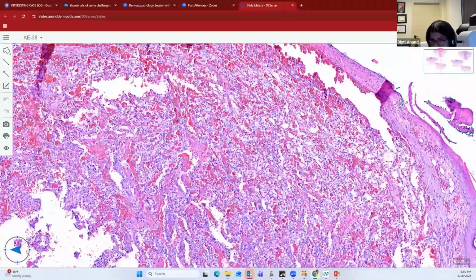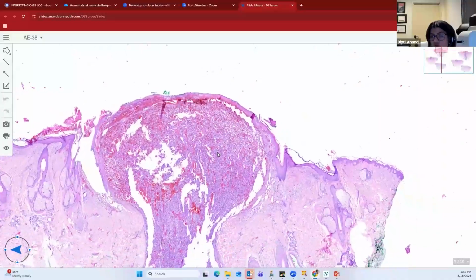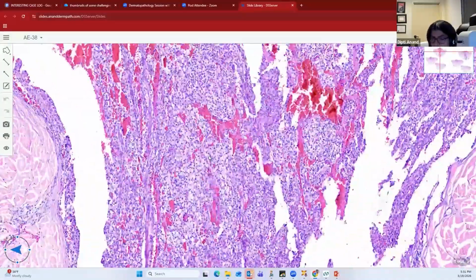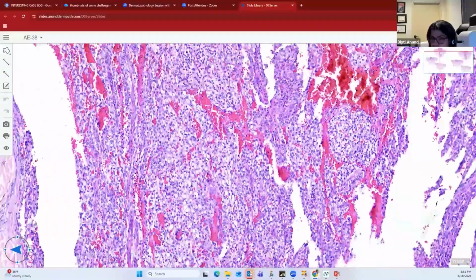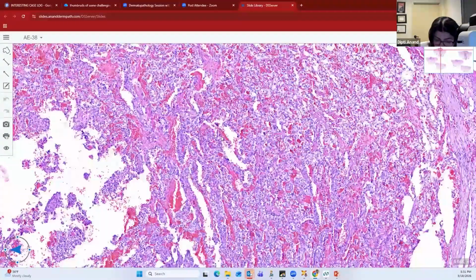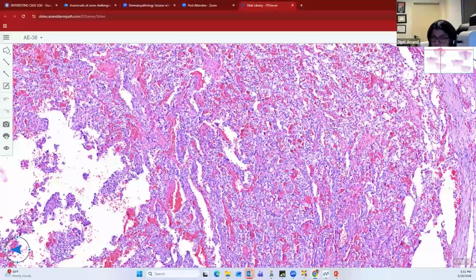B, you lack the solid cystic areas. C, you are not going to see glandular ductal elements or that nice dense pink hyalinized stroma like what I showed you. So look for all those clues for differentiation between metastatic RCC and your clear cell hidradenoma.